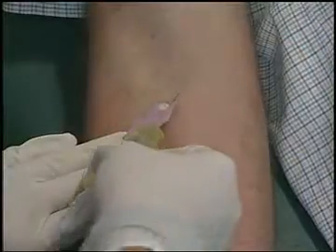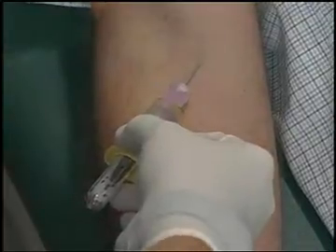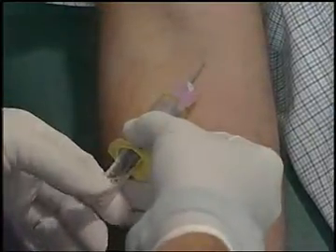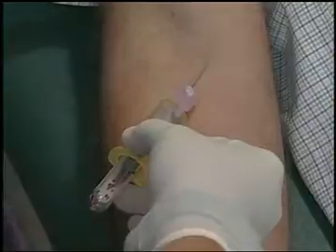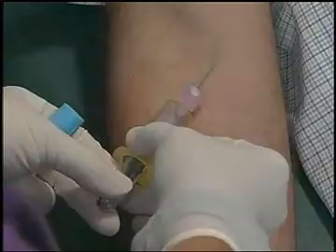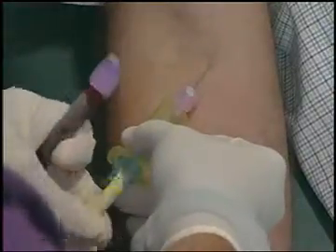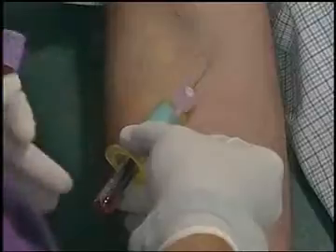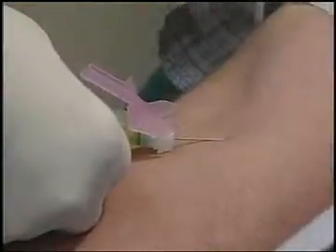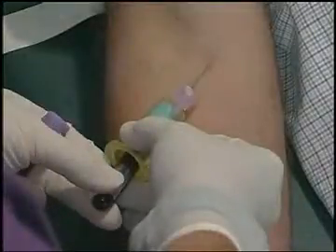While stabilizing the holder, push the tube into the holder. Use your thumb and middle finger to push the tube into the rubber sleeve. The vacuum tube automatically fills to 3/4 full. Once the tube is filled, remove it carefully without moving the needle and apply a second tube if needed. Always roll the tubes 5 or 6 times after you remove it to allow the blood to mix with the additive.